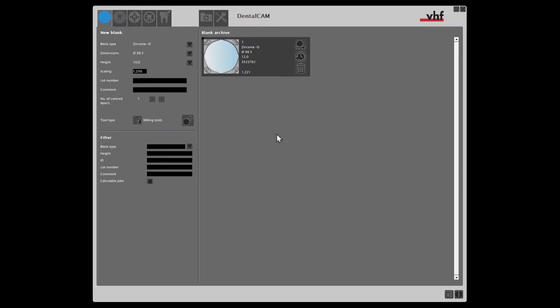In this video we will show you how to import STL files into a job. Let's load the already created disk from the blank archive.